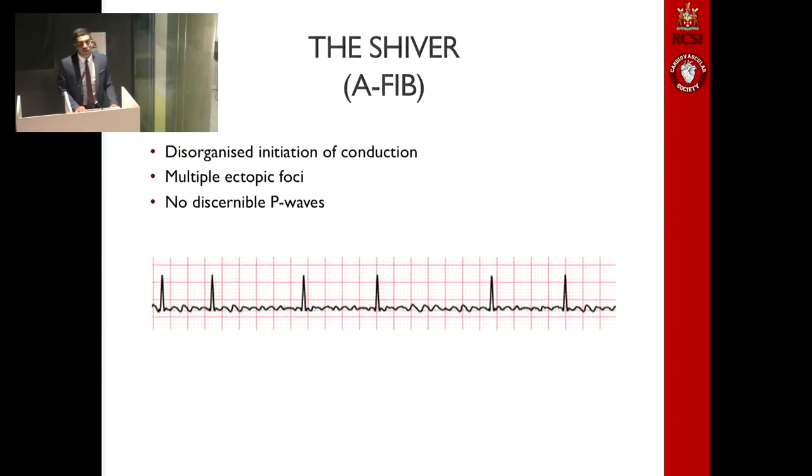Lastly, in terms of tachycardias, we need to be aware of the supraventricular AFib and aflutter. AFib is caused by a shiver of the atria due to multiple ectopic foci firing impulses in all directions. This is why we neither see a discrete P wave nor a smooth isoelectric baseline. What we do see, however, is an irregularly irregular QRS pattern. This is caused because the multiple ectopic foci fire impulses in different directions at different times, all of which is left up to chance.